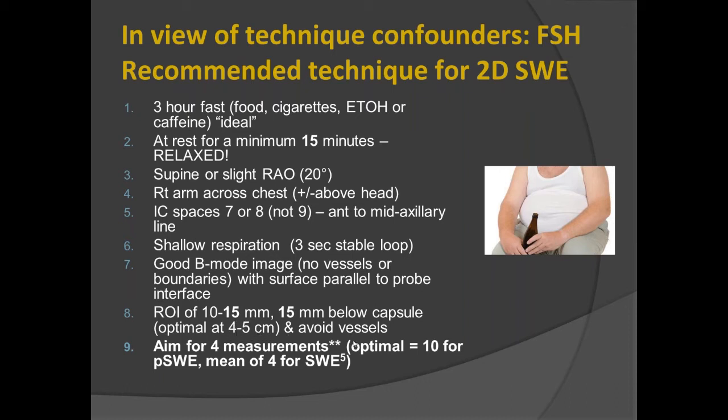And as we said, aim for 4 measurements, but in fact 3 measurements with a standard deviation of less than 20% fits the current WFUMB guideline.